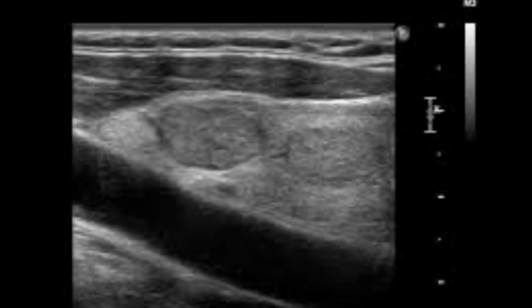Another example here for the better understanding, you can appreciate that this is the left lobe of the thyroid, and in this left lobe you can appreciate 2 nodules. These nodules are well defined, round in shape, and these are slightly hypoechoic as compared to the thyroid echogenicity.